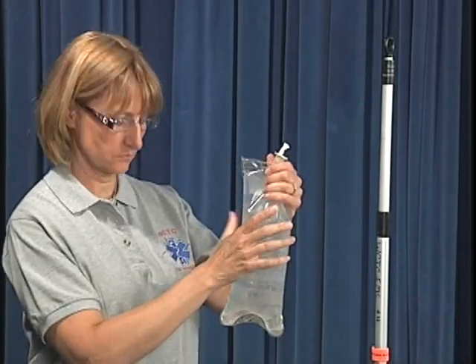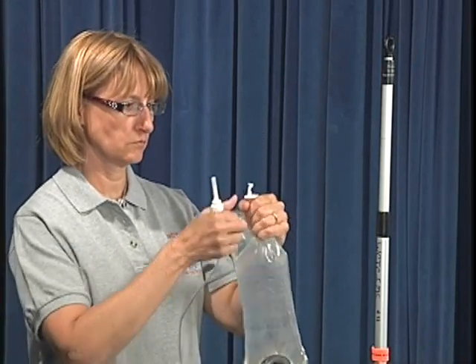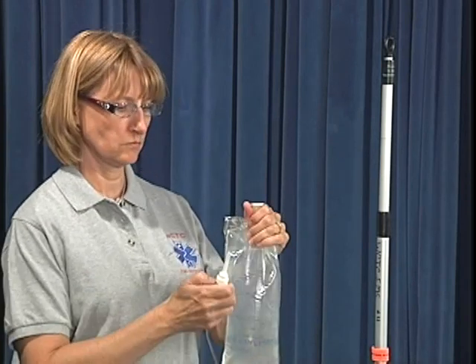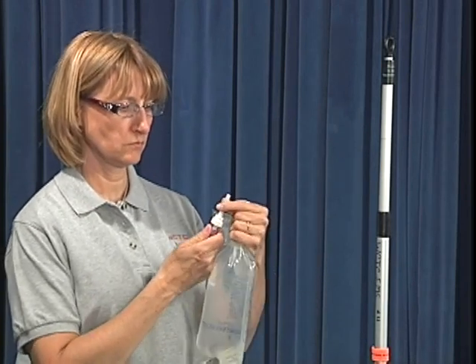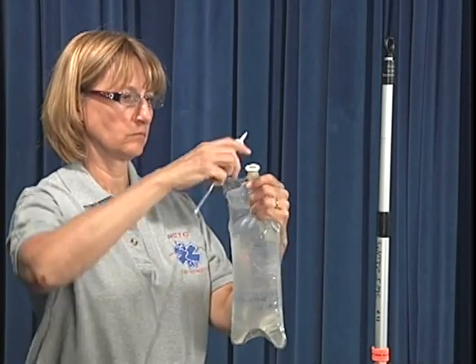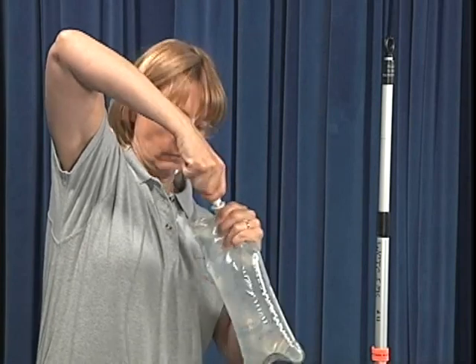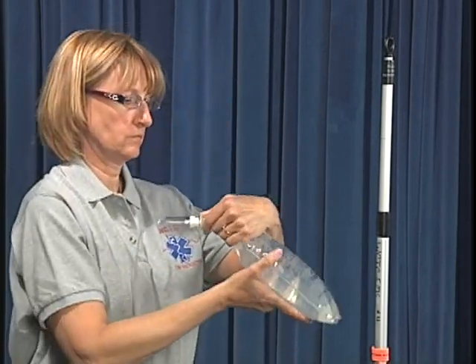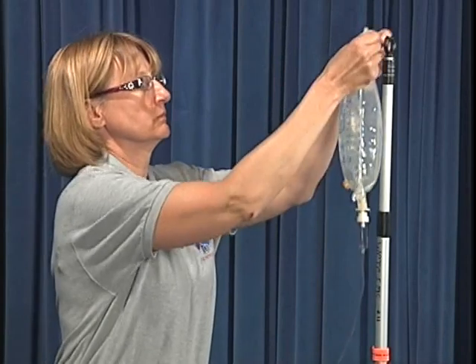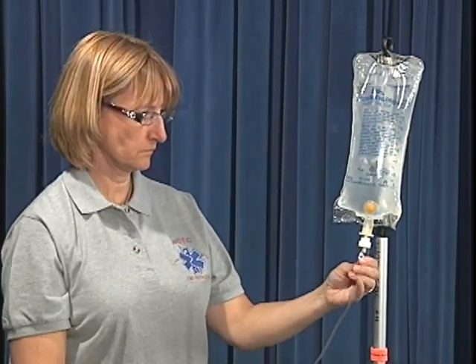A second method for spiking an IV bag consists of inverting the bag so the tail ports extend upward. Grasp the IV port just below the plastic tab and with the other hand pull the plastic tab from the port. Remove the protective cap from the IV tubing spike and insert the spike into the IV port by pushing and twisting until it punctures the seal. Then invert and hang the bag in an upright position and squeeze the drip chamber to fill it approximately half full of fluid.